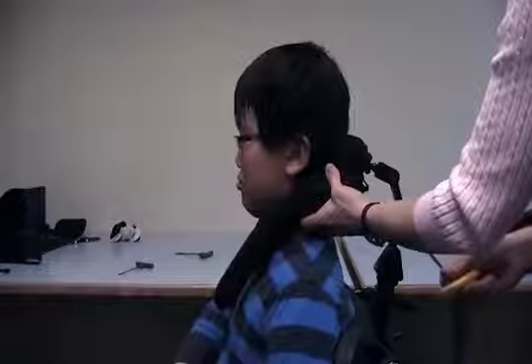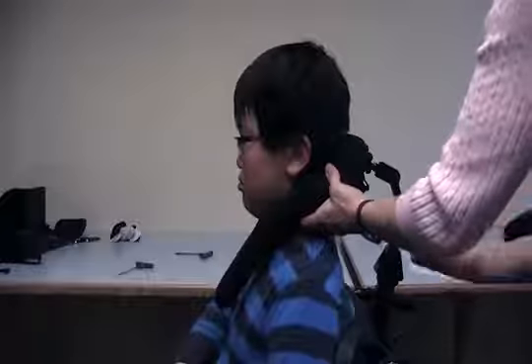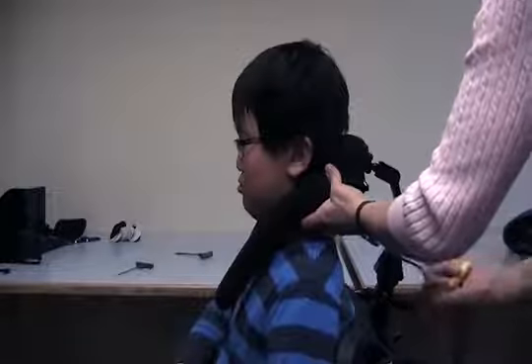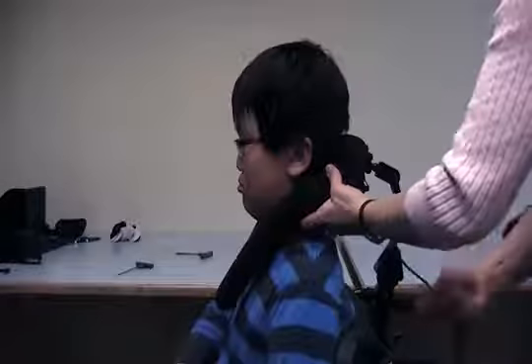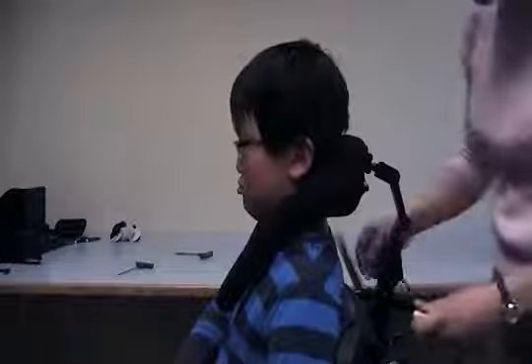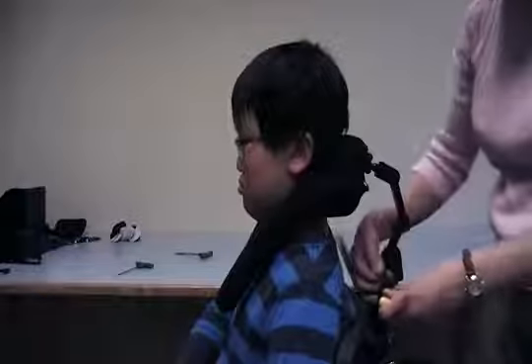If the client cannot maintain their head in this position or is extending during the adjustment, you can have someone else hold them in position.